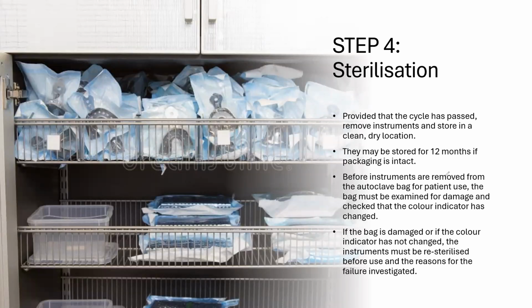Before instruments are removed from the autoclave bag for patient use, the bag must be examined for damage and checked that the color indicator has changed. If the bag is damaged or the color indicator has not changed, the instrument must be re-sterilized before use, and the reasons for the failure should be investigated, why it happened.